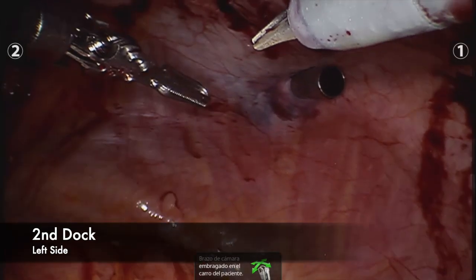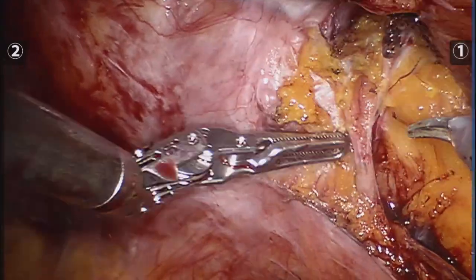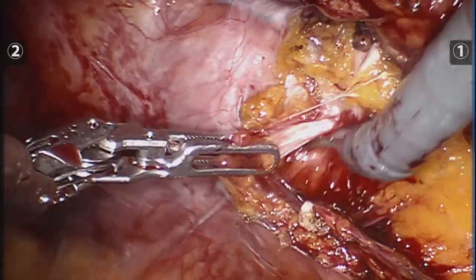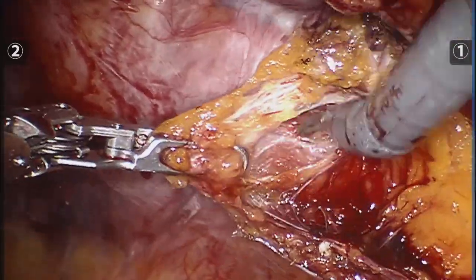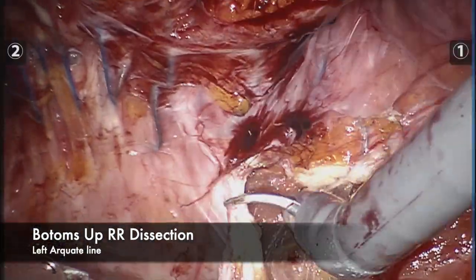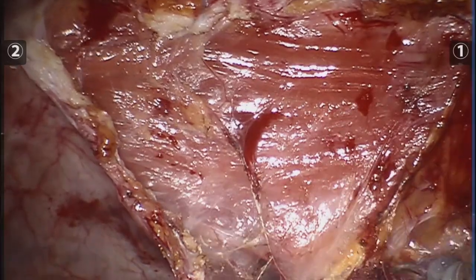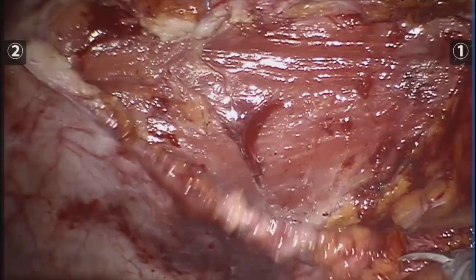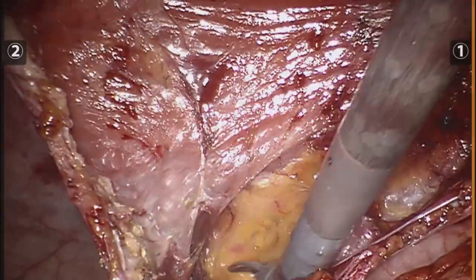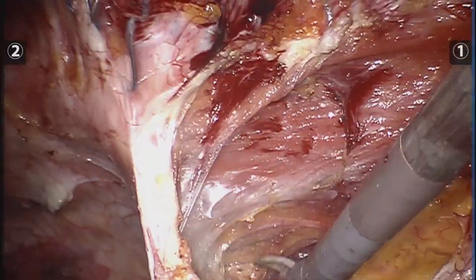We re-dock the robot, go to the contralateral side, and this time — since I am a right-handed surgeon — I felt more comfortable going bottoms up. I had to find the plane I had already developed during my crossover on the other side and get on top of the transversalis fascia in the retrorectus space and continue developing from there. I observed that a common mistake I had is losing the center of my dissection — I could see it on the console but it couldn't be seen on the screens. That's something I need to work on for my next cases.